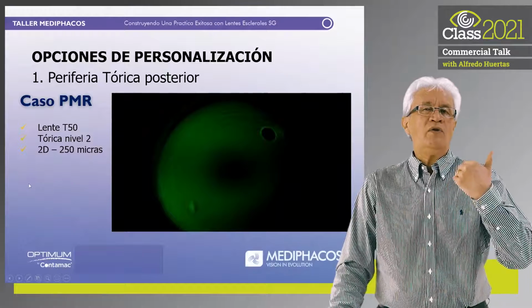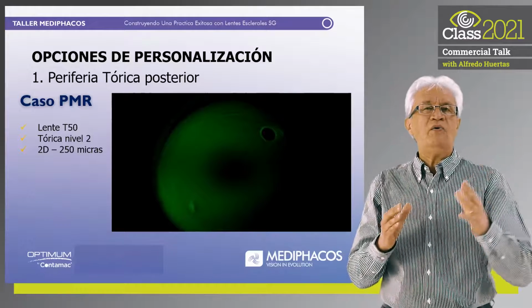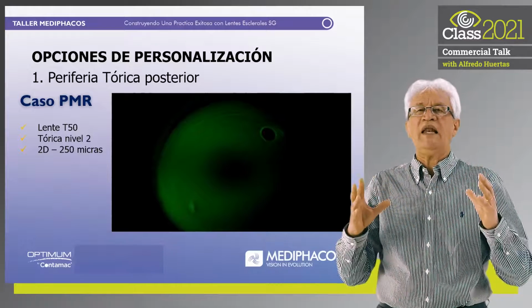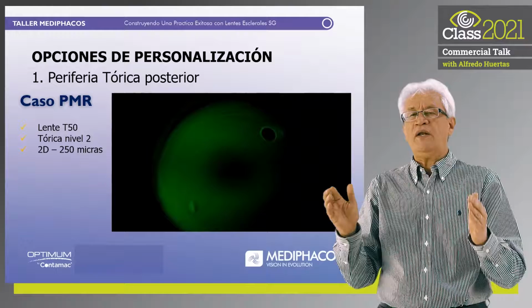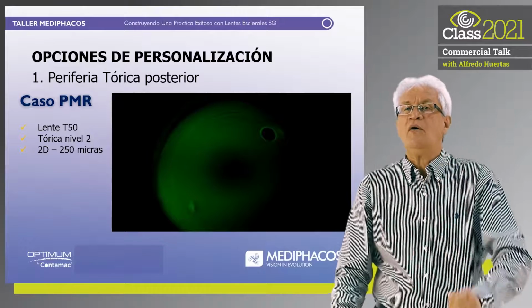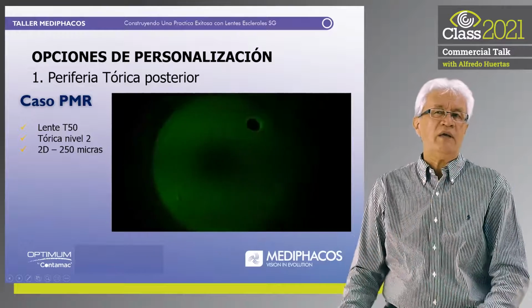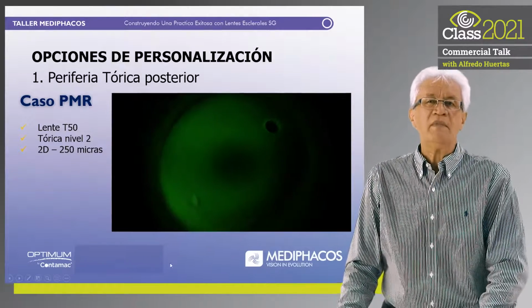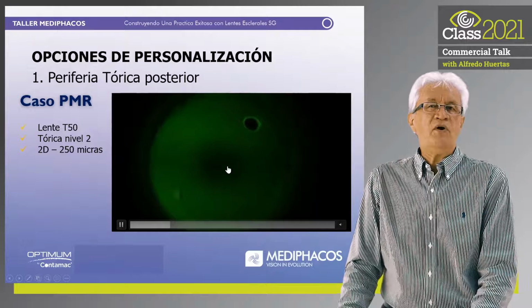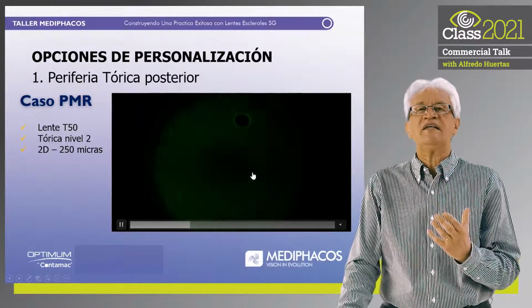Here you can see, as we continue with our clinical case in this video, and if you remember, we first did a test with the number 18 without a toric posterior periphery, where we observed a central touch with limbal touch from 0 to 180 degrees. But now let's see the video with the toric posterior periphery. We can observe that T50 decreased the touch. Our famous bubble is still there, but look how the touch decreased. Observe how the touch decreases and the centering improves by just changing to a toric posterior periphery.